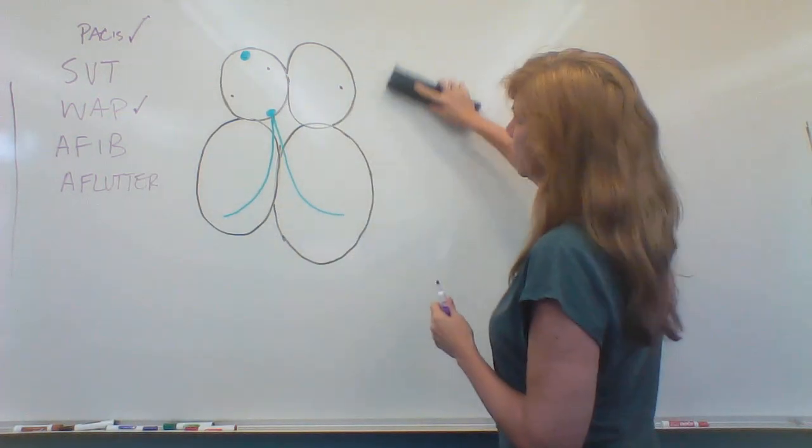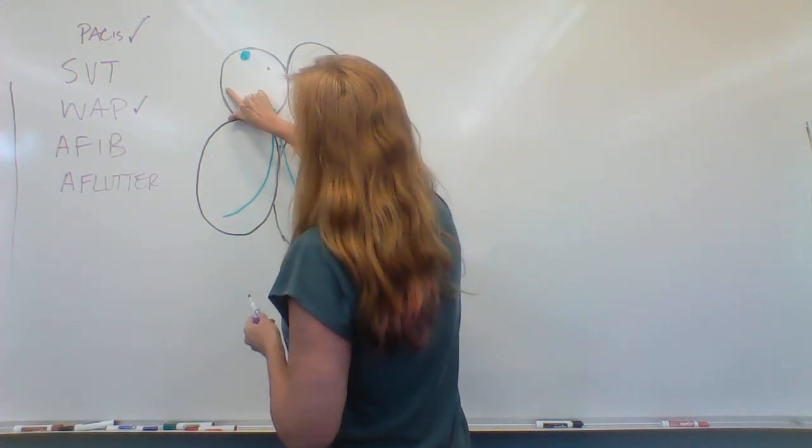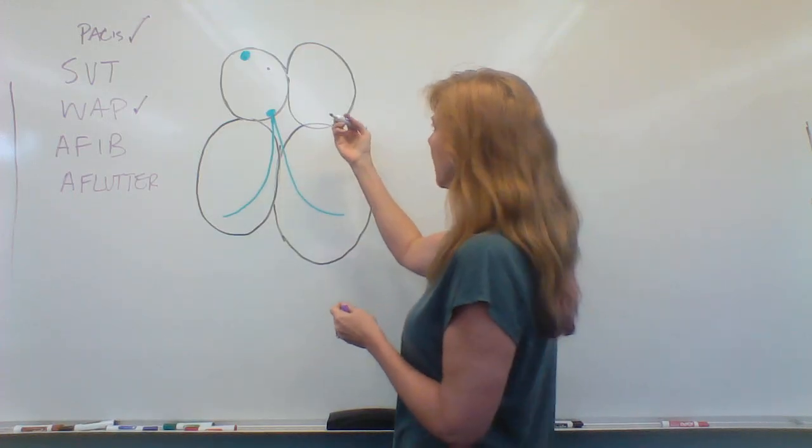Now we're getting into the goods over here. All right, let's go back to that original ectopic focus right here, this original bad guy.